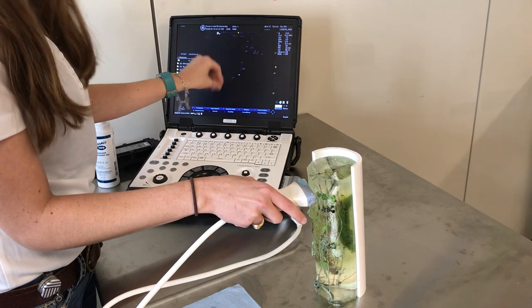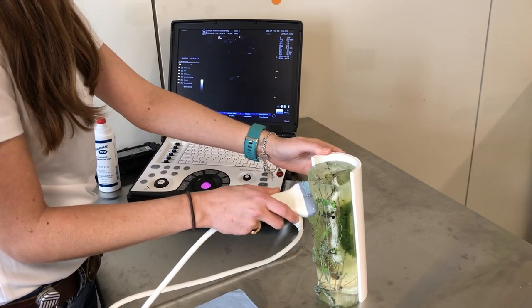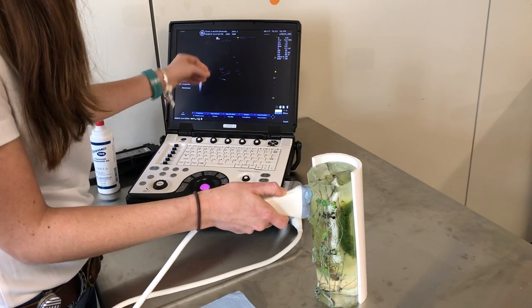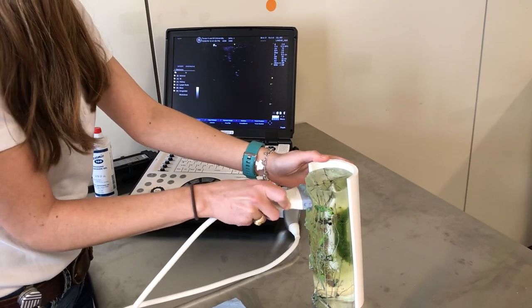I'm going to make sure to label my image so that if anyone else sees it, they know what's going on. And whenever you do a sagittal view of a structure, make sure your notch is pointed proximal. Similarly to the transverse image, we'll be sure to label it. So let's go and see what's going on with this limb.